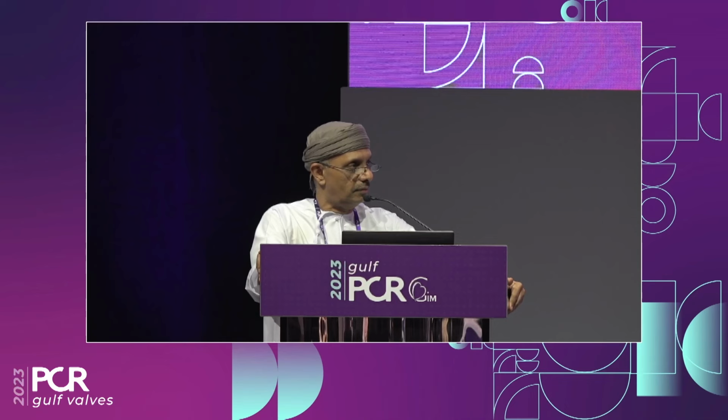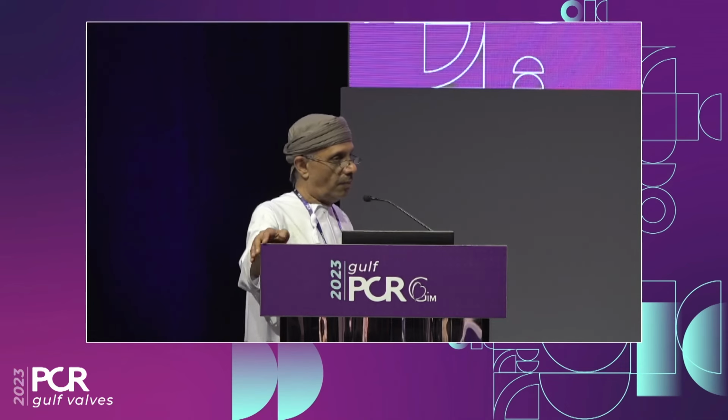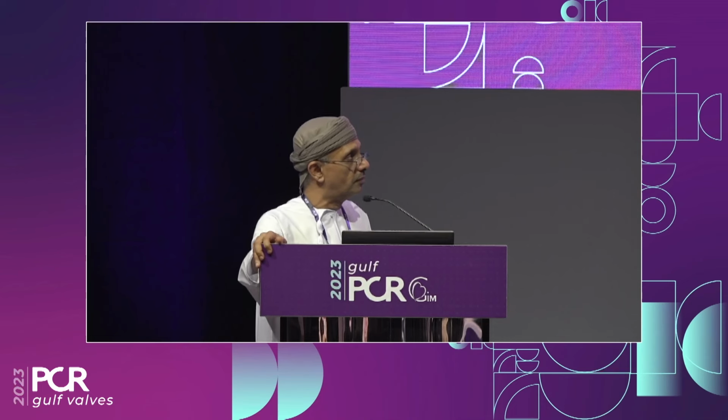So recently we did a case, zero calcium, rheumatic aortic valve. She was having a tortuous aorta, a very frail lady. As a person using another platform a lot, putting in my first 5 or 10 cases of Navitor, I was so scared, like what's going to happen? Zero calcium.